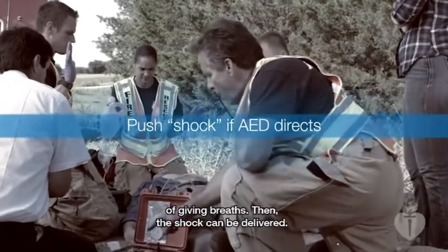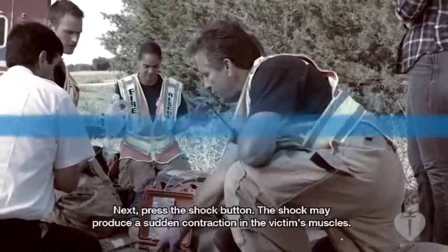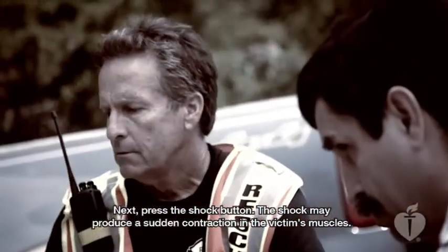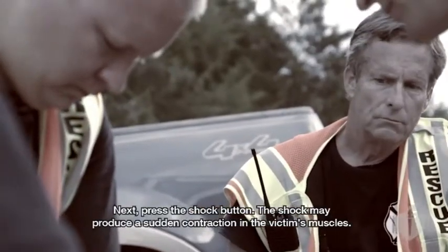Then the shock can be delivered. Press the shock button. The shock may produce a sudden contraction in the victim's muscles.